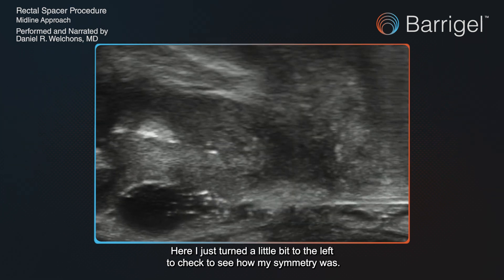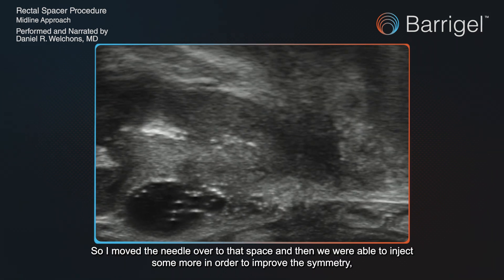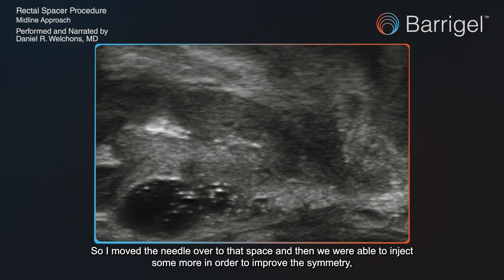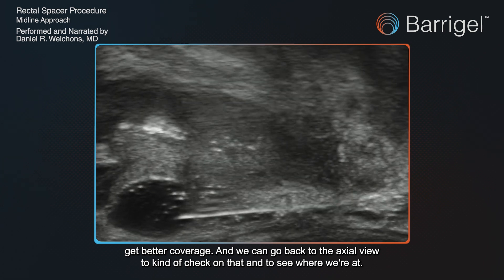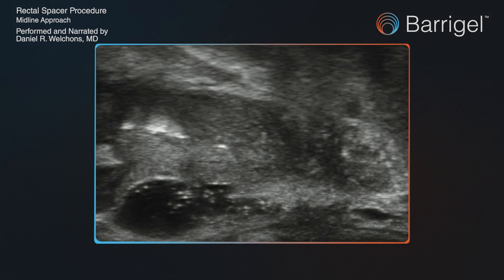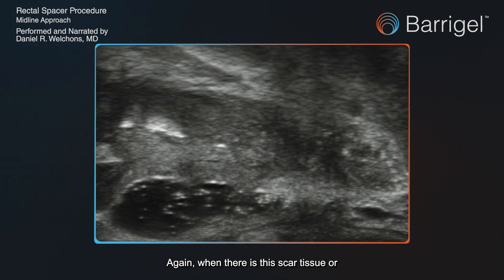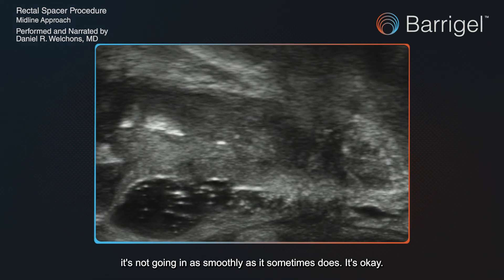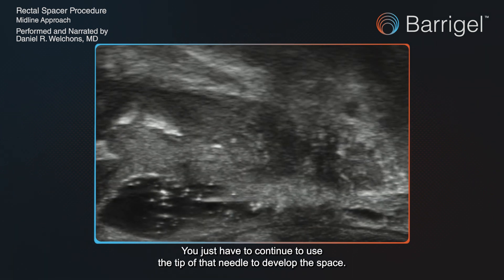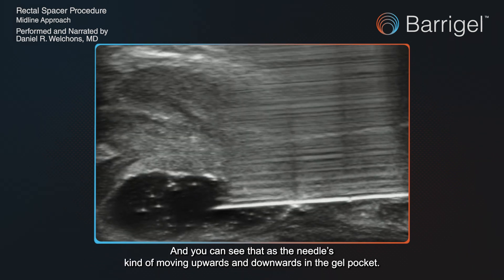Here I turned a little to the left to check how my symmetry was, and we saw there was a little absence of gel, so I moved the needle over to that space and injected more to improve the symmetry and get better coverage. We can go back to the axial view to check on that. When there is scar tissue and it's not going in as smoothly as it sometimes does, that's okay — you just have to continue using the tip of the needle to develop the space, moving it upwards and downwards in the gel pocket.